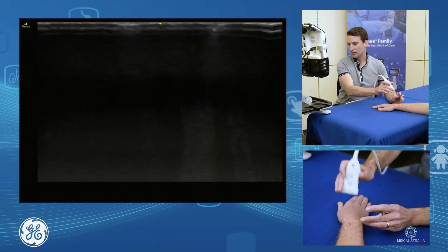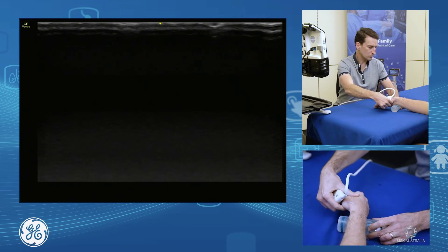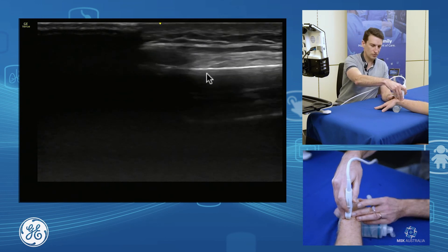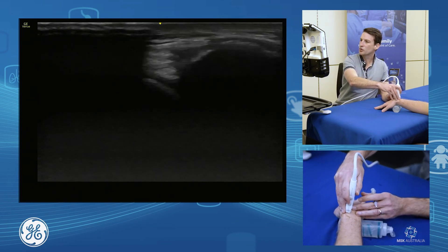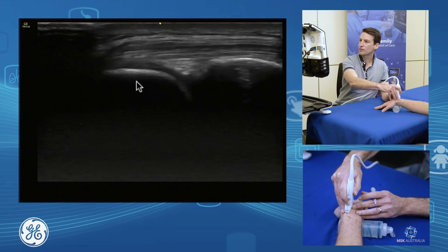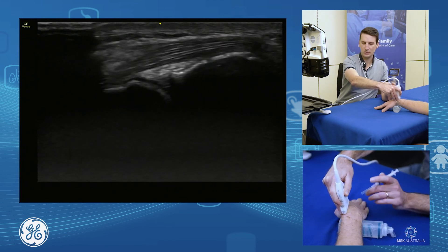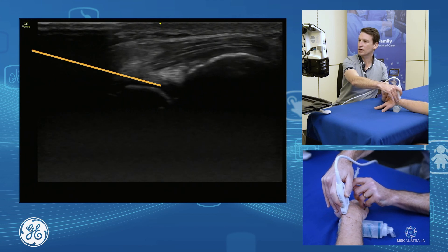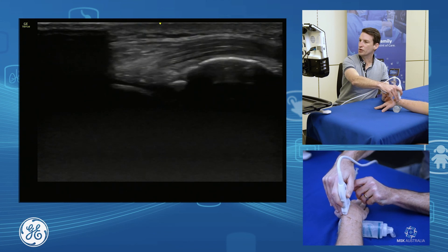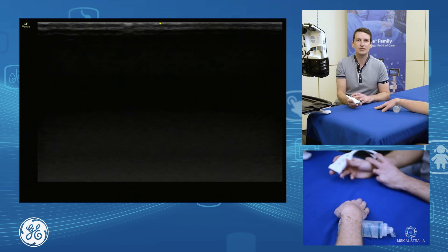For our wrist joint injections, one little trick is to get a little more flexion of the wrist — we just roll the patient over and that opens up our joint nicely. Again on the radius, we move our probe down, find our joint line, come off the tendon, and needle in, guiding it down into the joint. So that's our wrist joint injection, and that covers our dorsal wrist — our joints and tendons.